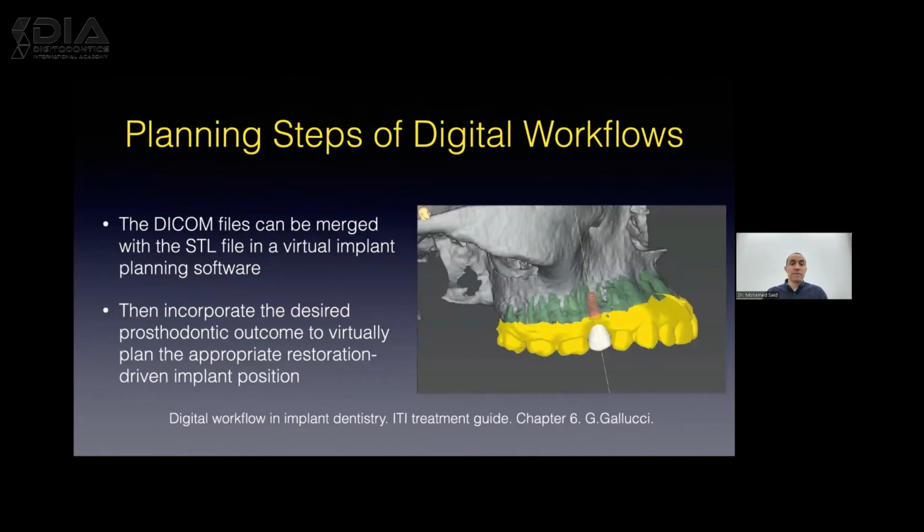The DICOM files can be merged with the STL file in a virtual implant planning software. As you can see here from the image of the digital workflow in implant dentistry, the ITI treatment guide, in yellow, you can see the STL file. And in green, you can see how the DICOM file has been segmented and separated and merged into the STL file. Then from this step, we can start planning for our restoration.